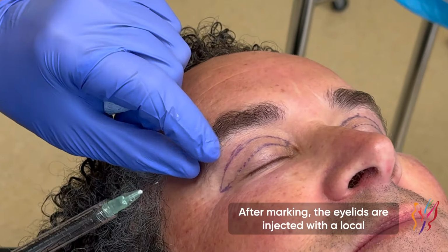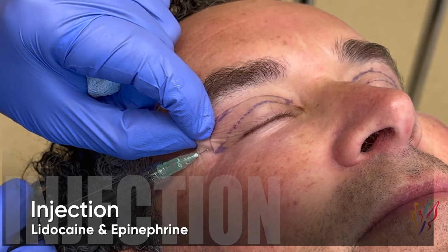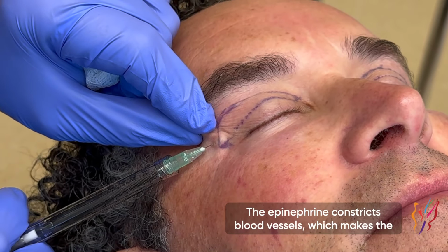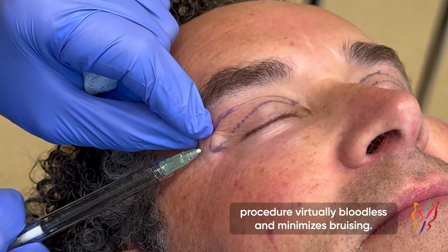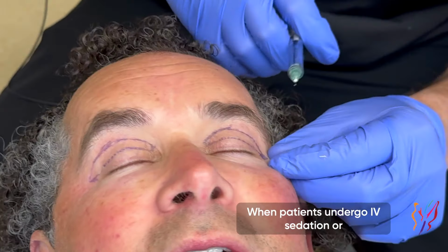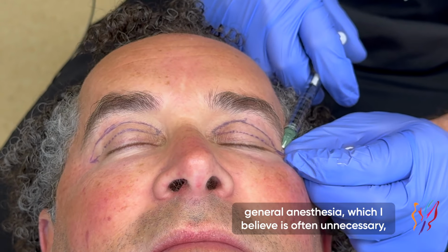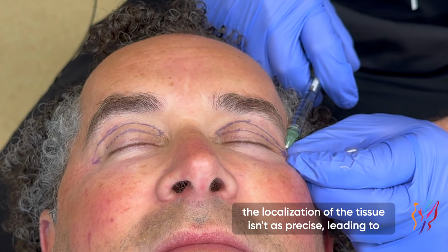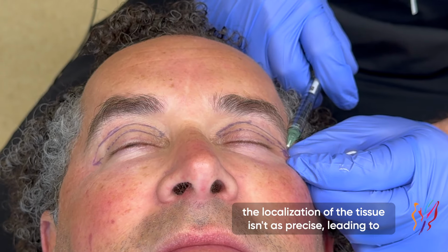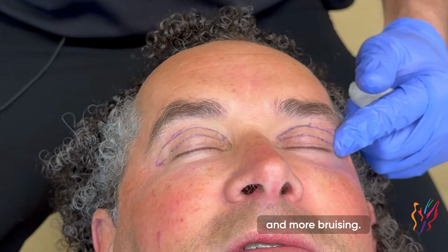After marking, the eyelids are injected with a local anesthetic that contains lidocaine and epinephrine. The epinephrine constricts blood vessels, which makes the procedure virtually bloodless and minimizes bruising. When patients undergo IV sedation or general anesthesia, which I believe is often unnecessary, the localization of the tissue isn't as precise, leading to more bleeding, longer recovery times, and more bruising.